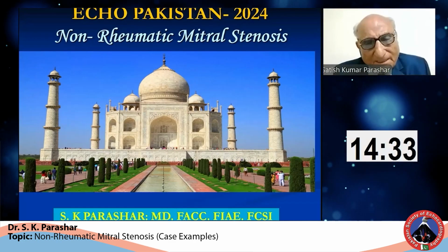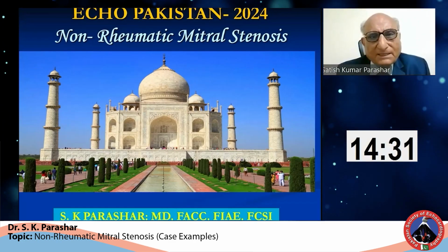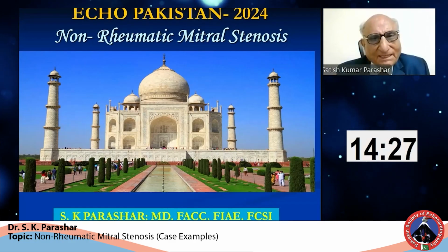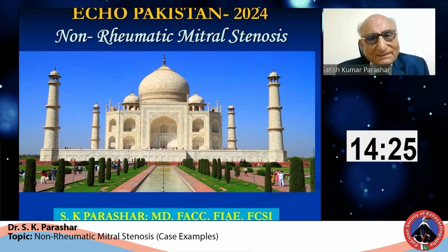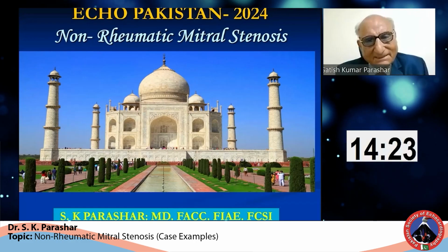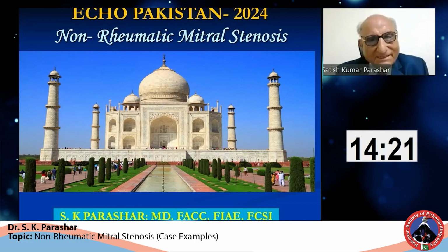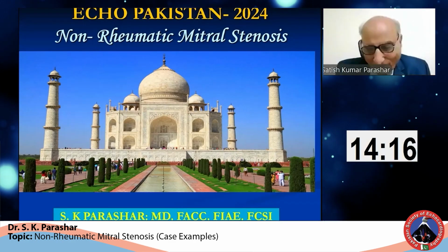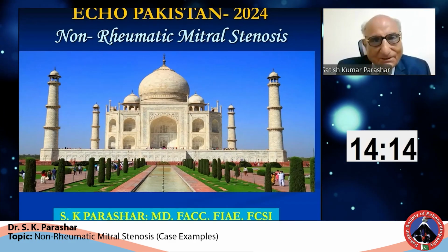Now, we are all seeing cases of rheumatic mitral stenosis, but in the last few years, we have seen many cases of non-rheumatic. So this is just to highlight these cases, and it will purely be a case-based presentation. And I fear it will be only for the echo persons or so.